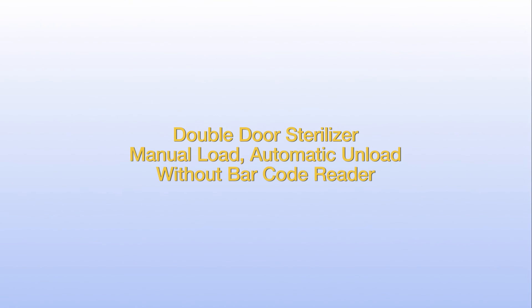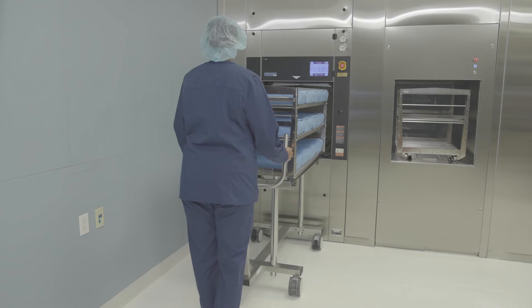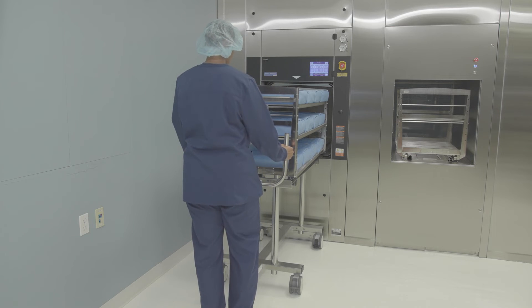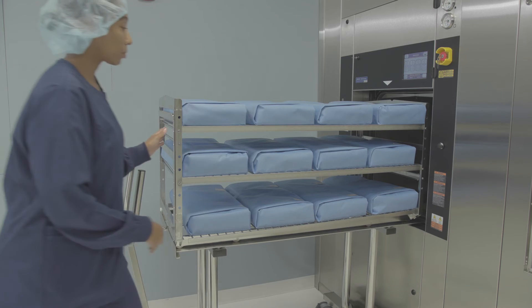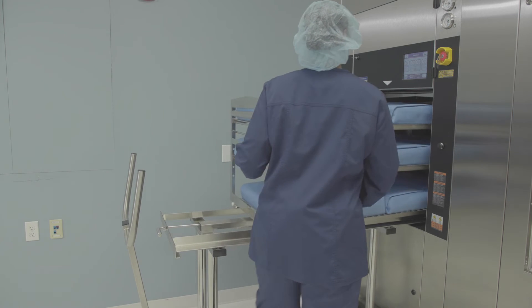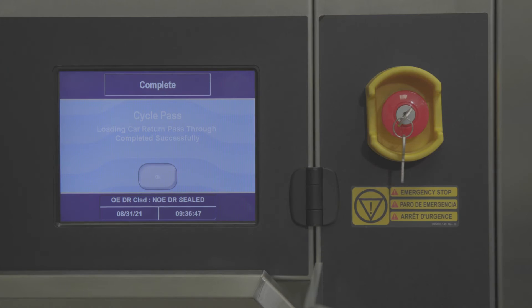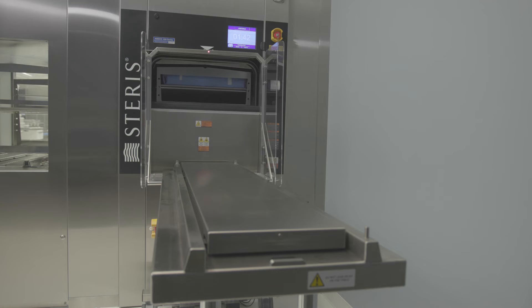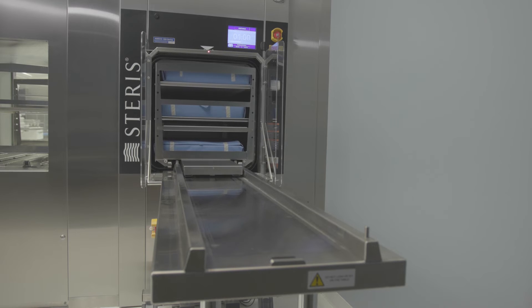If your department is equipped with a double door sterilizer with automatic unloading only, use the transfer carriage to manually load the next loading car. Connect the transfer carriage to the sterilizer, turning the locking handle to the right. Pull back on the handles to ensure the transfer carriage is securely locked to the table. Lock the rear casters, then manually push the loading car into the sterilizer. Close the sterilizer door and choose the appropriate cycle for the type of instruments being processed. When a cycle is complete, the sterilizer automatically detects if a sterile load is on the unload table. If the unload table is empty, the unload side chamber door opens and the system automatically removes the processed instruments.